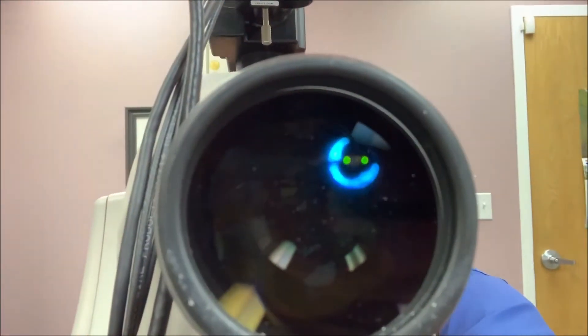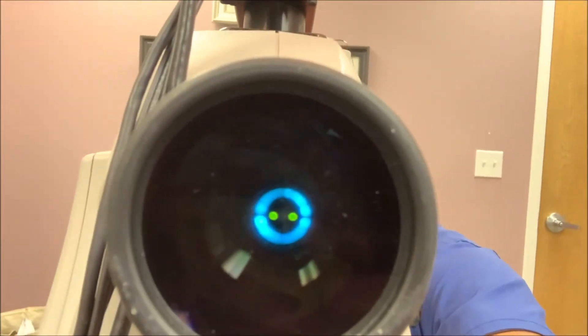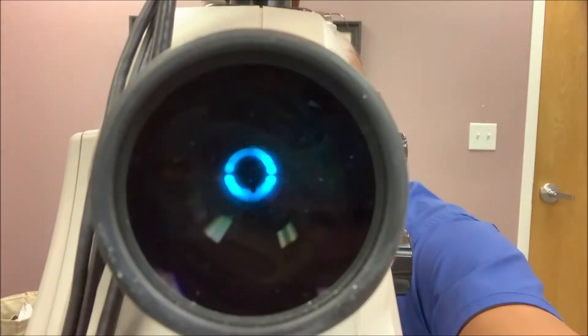Photographs are taken while I'm viewing your eye from this side of the camera. The flash looks like this. We will photograph you at one minute, at three minutes, and at six minutes.